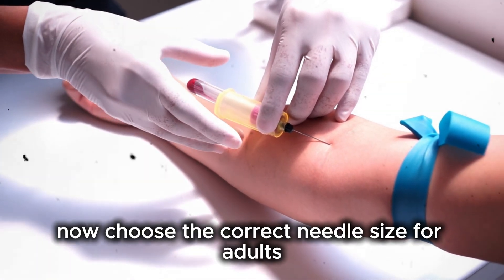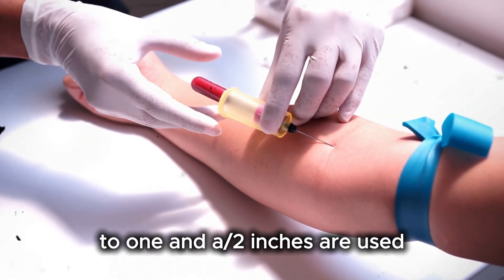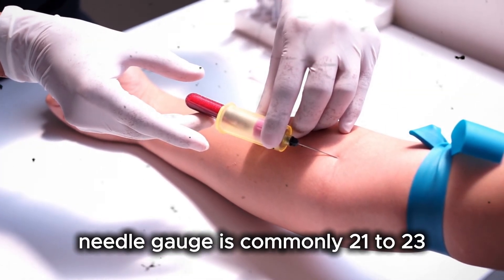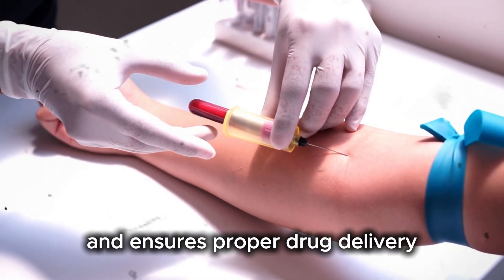If the medicine is in a vial, clean the rubber stopper with an alcohol swab. Draw air into the syringe equal to the medication dose. Insert the needle into the vial and inject the air. Turn the vial upside down and draw the required dose. Again, remove air bubbles carefully. For adults, usually a needle length of one to one and a half inches is used depending on muscle mass. Needle gauge is commonly 21 to 23.